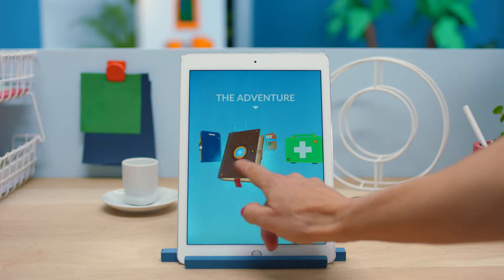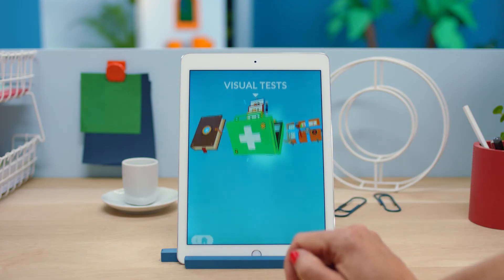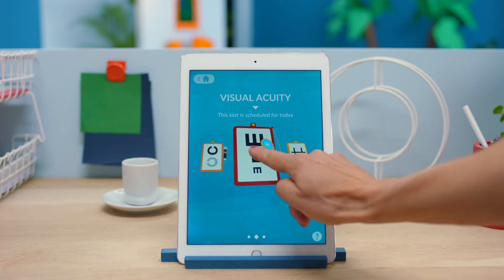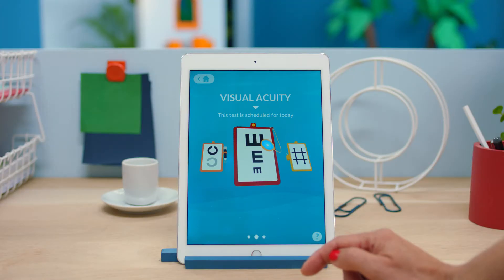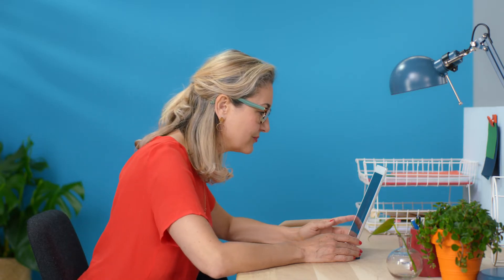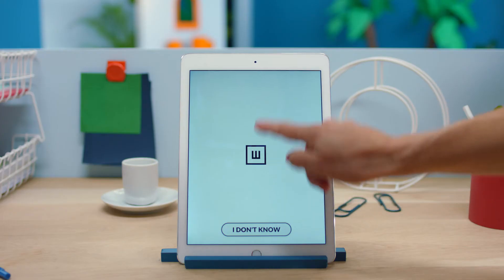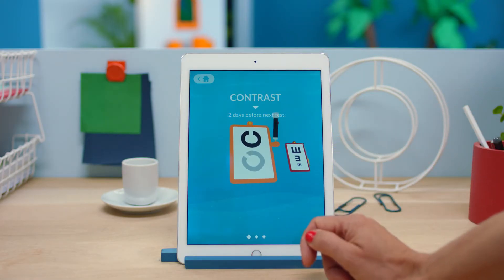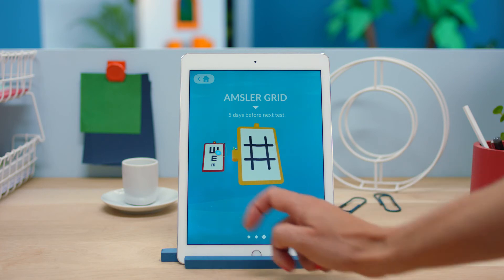Now we're going to make some medical tests together in order to calibrate the game and make sure our exercises are relevant for you. Here's an example: the visual acuity test. Put the screen to the right distance from your eyes, close an eye and swipe. We also use a contrast checker and an Amsler grid.